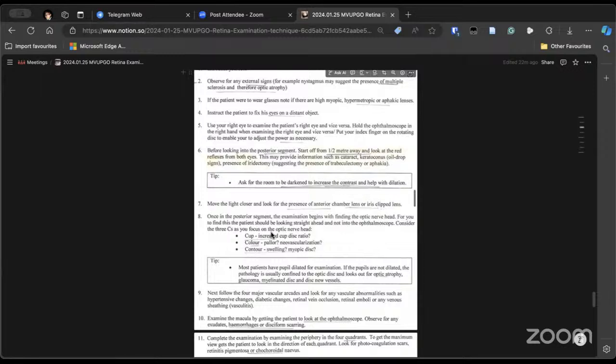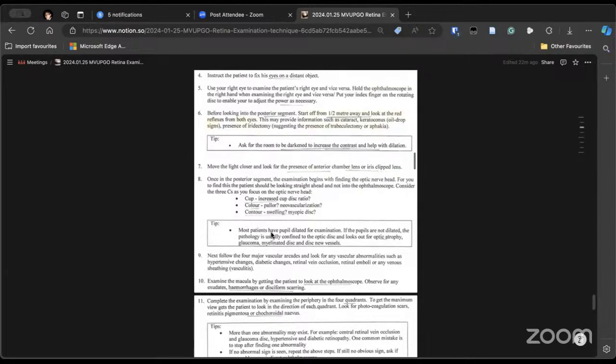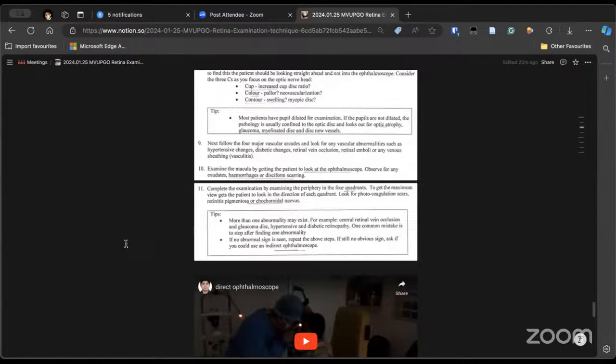So then you see the disc, and then you go to the vascular arcade. And if you do not see the disc, you are seeing vessels. How do you go to the disc? Look at the diameter of the vessel and follow the thicker vessel. There will be dichotomous branching of the vessels. So you go to the center because all of the vessels are actually coming from the disc. And then you look for vascular abnormality, you examine the macula at the last, and you can see the periphery also. Some amount of periphery can also be seen in this.